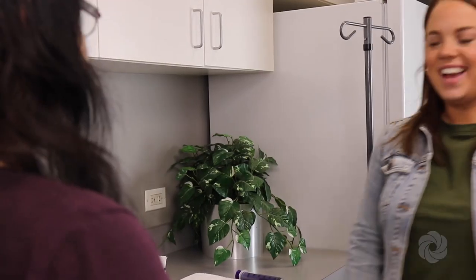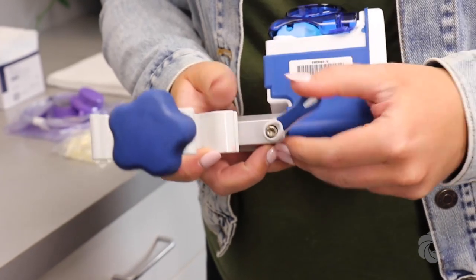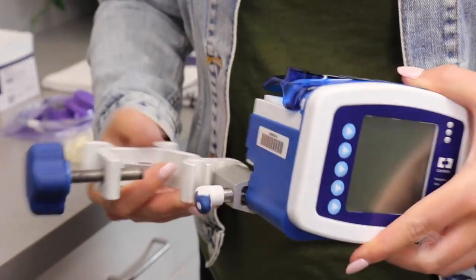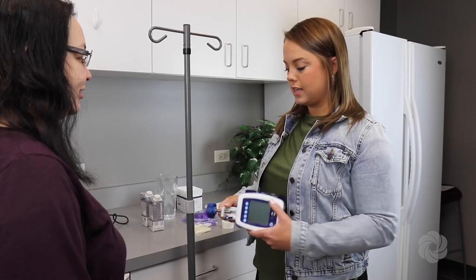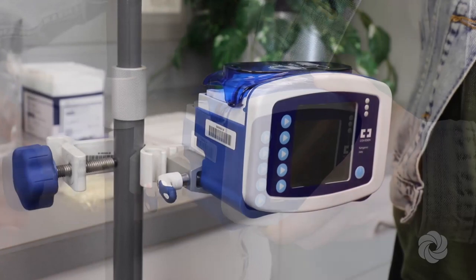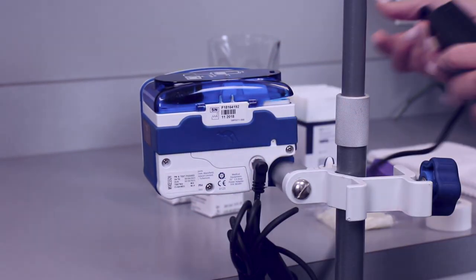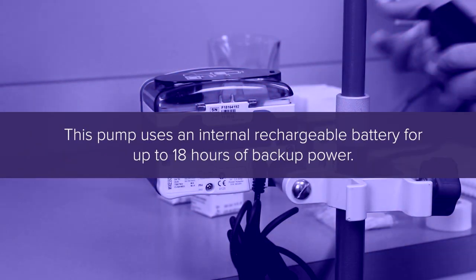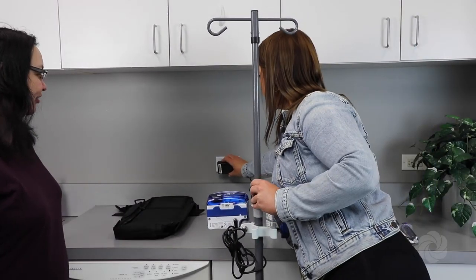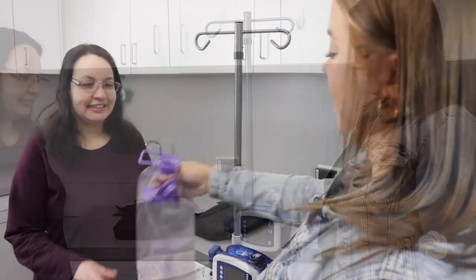When using the pump on a pole, start by attaching the pole clamp to the pump by turning the blue and white handle to the left to lock the pump in place. Then mount onto the pole by turning the blue knob to the right clockwise until it is tight and securely in place. Insert the power cord into the back of the pump. This pump uses an internal rechargeable battery for up to 18 hours of backup power.